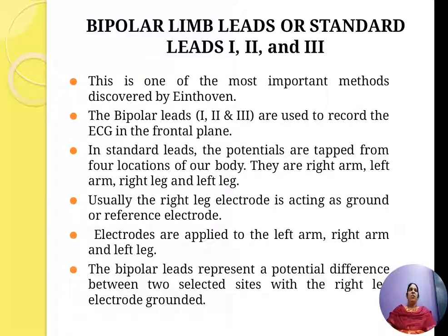Bipolar limb leads or standard leads. We have lead 1, lead 2 and lead 3 configuration. In the standard lead configuration, the potentials are tapped from, I would like to say that this is one of the most important methods, which was discovered by a scientist named Einthoven.